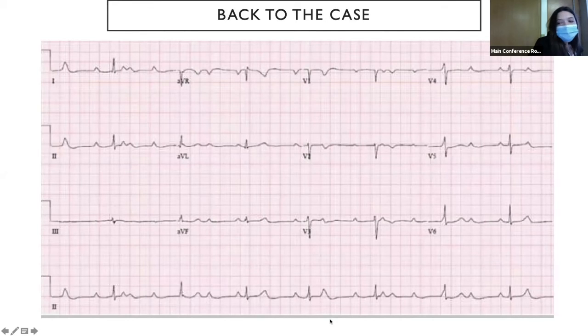So it's around 45. Yeah, and that's basically what you said before. But if you actually look at the atrial rate, here's a P wave, here's a P wave, there's another P wave. It looks like there's one buried here in the QRS complex. So the rate of the atria is about 90 beats per minute.